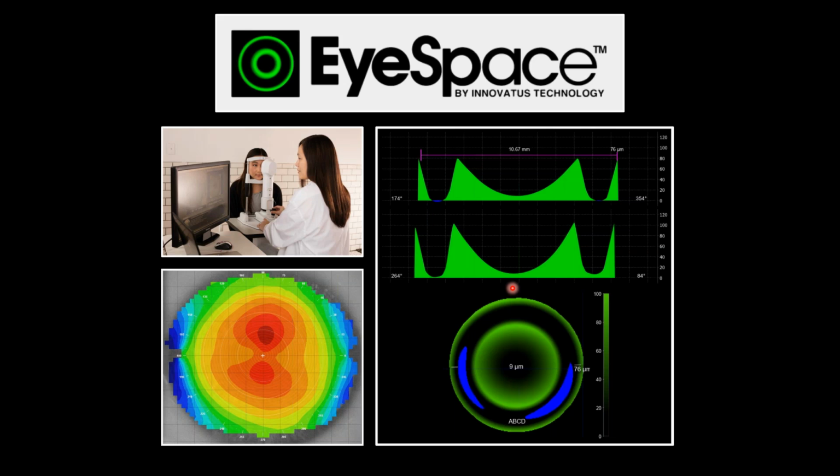And I can tell you that almost 100% of our rigid contact lenses are built using some kind of 3D mapping software like the EyeSpace to construct our irregular corneal lenses, our ortho-Ks, and then of course any of our regular corneal GPs, multifocals and single vision lenses.